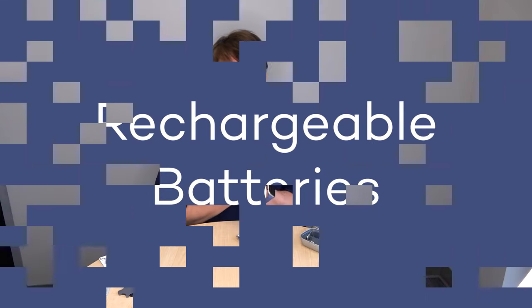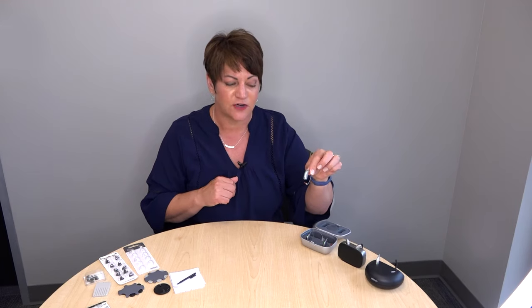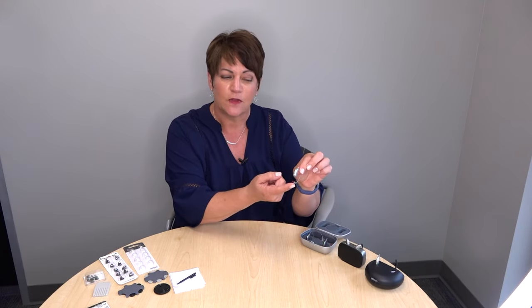Let's talk about rechargeable batteries. About 90% of what we're currently doing in our clinic is rechargeable. I have three sets of hearing aids here that are all rechargeable. What you need to know is that your devices need to go on the charger when you're not wearing them. You cannot overcharge them — just plug the charger into the wall. When you put your hearing aid in the charger, the bottom of the hearing aid always goes in first.